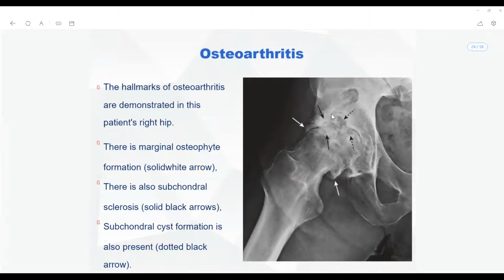The same way the ossification centers appear, certain parts of the bone will have stress-bearing areas. So depending upon the stress-bearing areas, I look for subchondral sclerosis only in those particular areas. Again, let me recall all the characteristic features here.